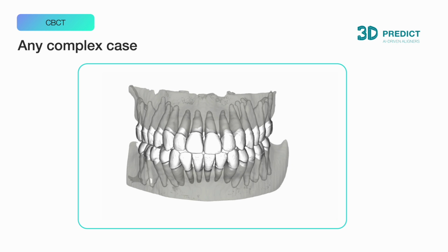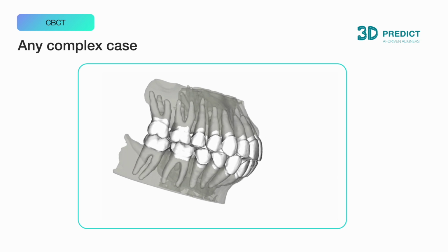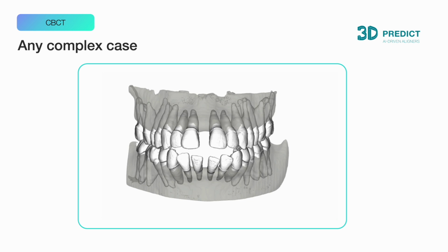A final word on complex cases. Here we see an extensive open bite case. This case is difficult, will take a long time, and will require refinements due to going outside of predictability limits. Although a CBCT will be needed for it, I highly suggest starting your journey with us.